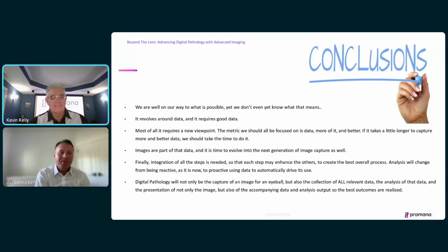So the first thing is always look at what you need. Ask yourself the same question that I ask the first time I meet a customer, which is, what are you doing with digital pathology today, and what do you want to do with digital pathology tomorrow? And once you figure that out, that answer, and only your institution can come up with that. Some people say we just want to do frozen sections. Other people say, you know what? We have an institution-wide initiative to embrace digital pathology every way we can. What's the best way to do that? That's going to dictate the platform that best serves your needs.